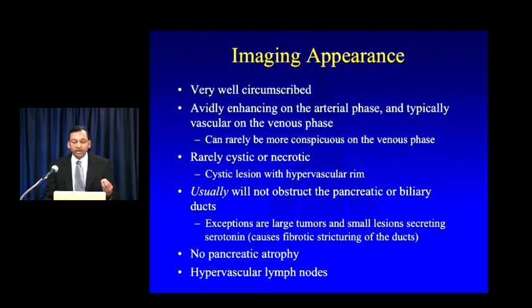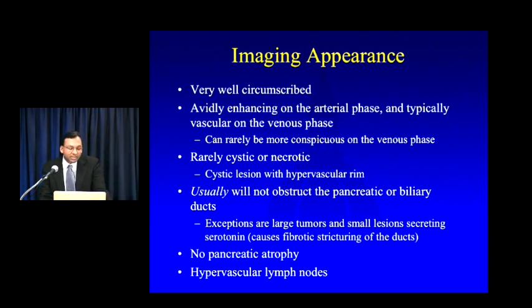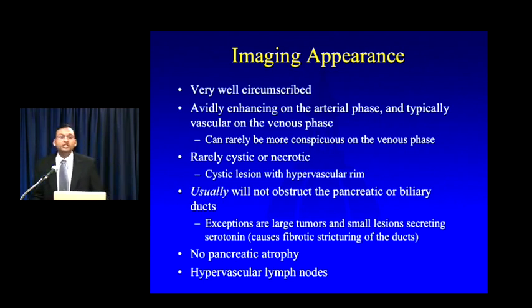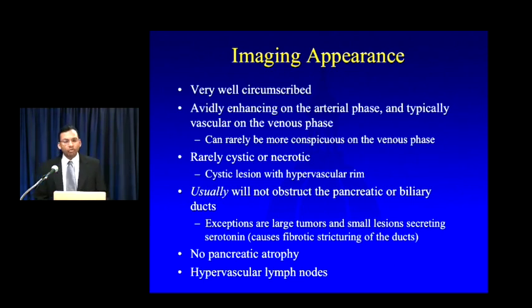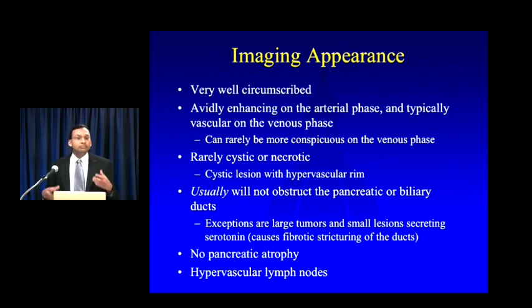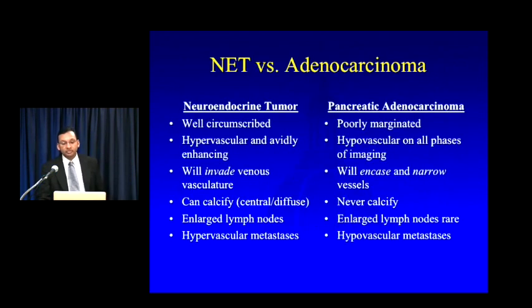NETs can rarely be cystic or necrotic — so cystic they can mimic IPMN — but in those cases with a significant cystic or necrotic component, there's almost always a surrounding rim of hypervascular soft tissue. Unlike adenocarcinoma, neuroendocrine tumors typically will not obstruct the pancreatic or biliary ducts, though large tumors can cause obstruction, and a small category of NETs secreting serotonin and similar hormones can cause fibrotic stricturing of the ducts. Upstream pancreatic atrophy is almost never seen, and it is not uncommon to see big bulky local regional nodes that are often hypervascular on the arterial phase.